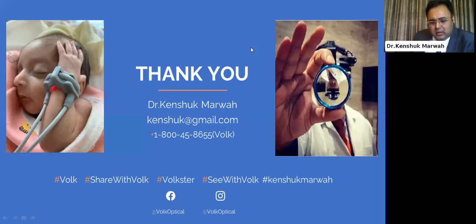I would suggest the special tissues that come in the white pouches, if you have access to them, or a Volk lens pen, which is the best. The pen has small micro bristles, which help remove dust from the edges of the rim where the lens is attached.